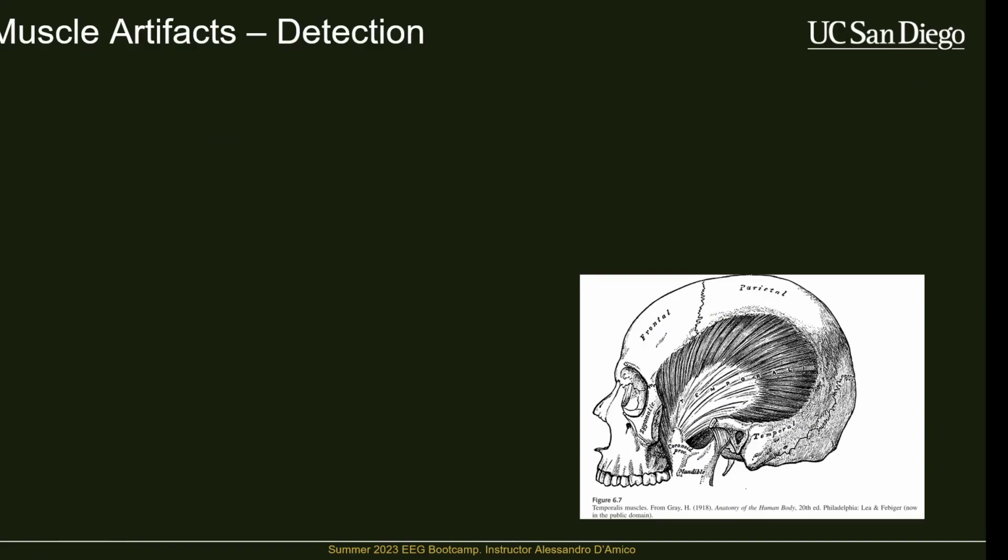Muscle artifacts are mostly caused by the fact that the most common ones are around the temples. There's these giant muscles, the temporalis muscles, and if you look at the activity of electrodes that are directly on this region, they're essentially always noisy. So even if you have really, really good recording quality, you're the best EEG researcher in the world, and you can cap people perfectly, you'll still often find that, especially in these regions right here with electrode locations T7 and T8, they're just almost always noisy. And that's because these muscles are gigantic.